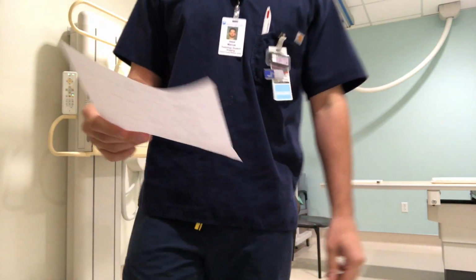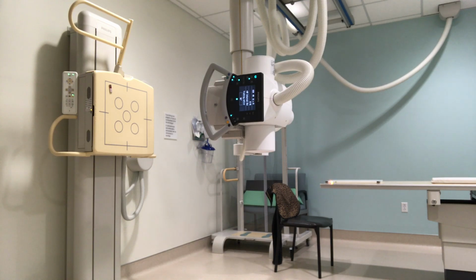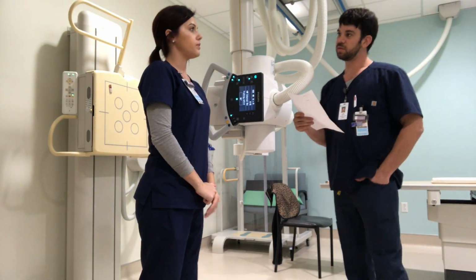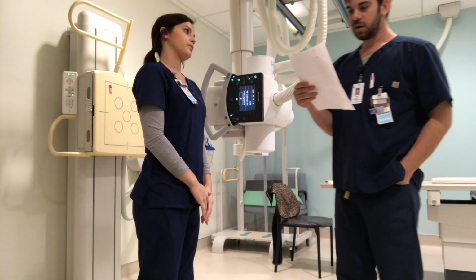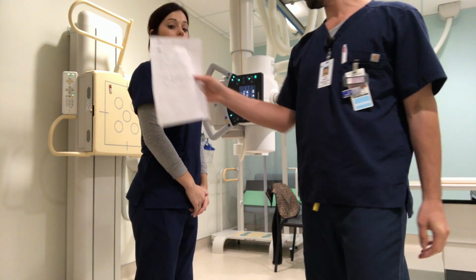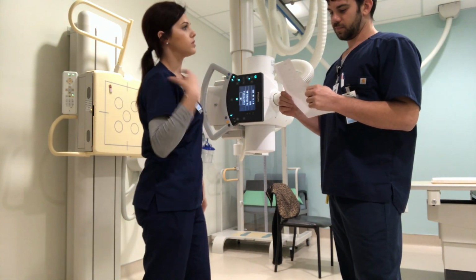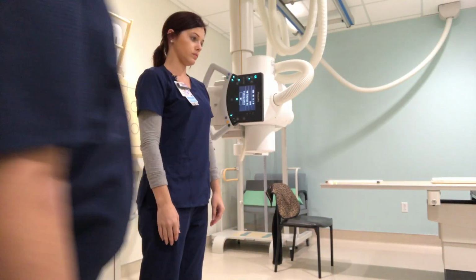All right, so let me go get my patient and see if they're ready. Madeline? Hi. Hello. Can I get your full name? Madeline Ortiz. And date of birth? 11/23/93. Okay, any chance of pregnancy? No. Good. So, looks like I have an exam for a right shoulder. Is that correct? Do you feel any pain in your right shoulder? Yeah. Tell me what happened. I kind of fell a little bit on it, and it's just been bugging me ever since. Okay. We're going to take some pictures of that. We'll get that over to the doctor.